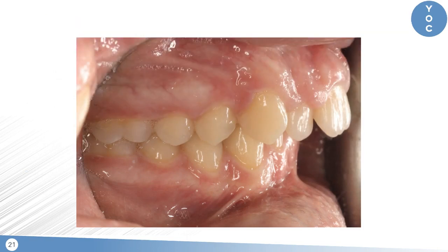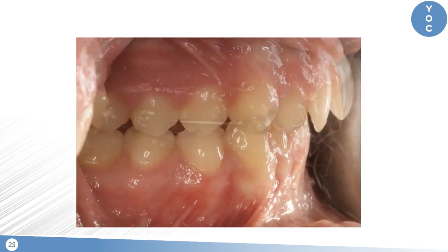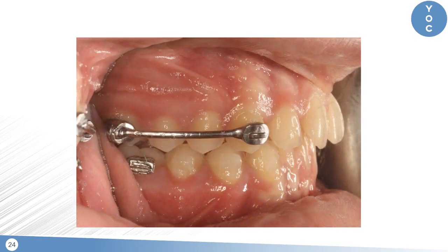Here's an example — a case I started where after a couple of months we got them into a class 1 platform, slightly overcorrected, ready to transition to upper and lower aligners. That said, this is a case I would not recommend scanning with the motion appliance on because there's really no visible anatomy of the tooth gingival to the bracket pad on the upper six. In contrast, here's another case where there is quite a bit of tooth anatomy gingival to the bracket pad on the upper six — so this is a case where scanning with the motion appliance on would likely give a predictable result when the upper aligners come back.